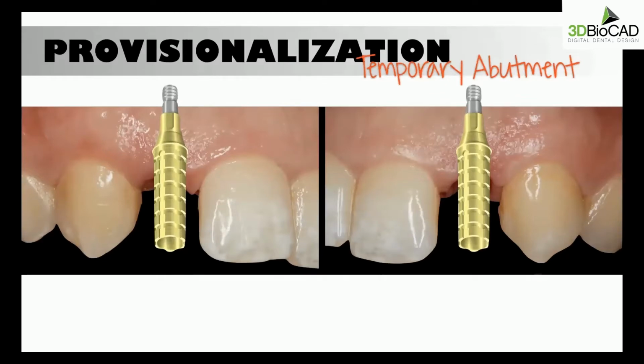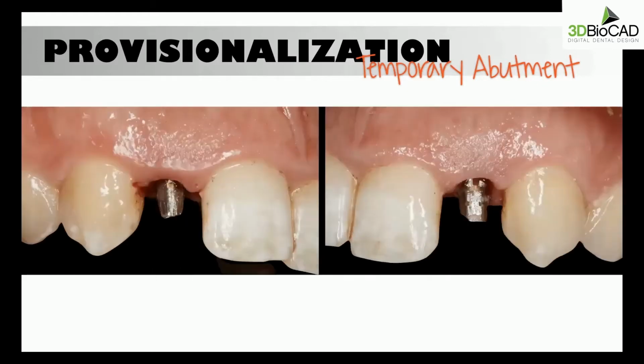And then we placed the temporary abutments in, and I adjusted the temporary abutments so that the temporary shell or the natural tooth that we're using can seat in place without interfering with the temporary abutments.